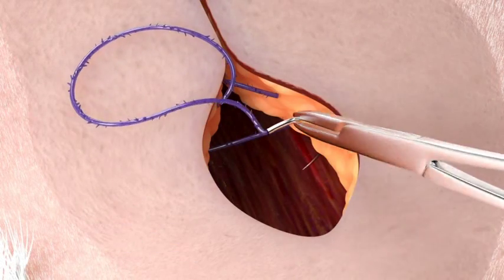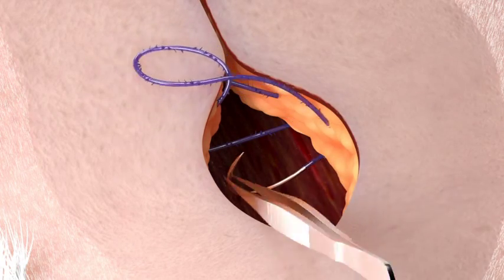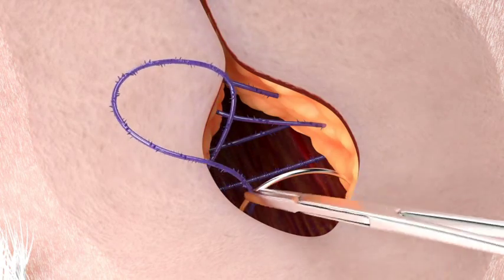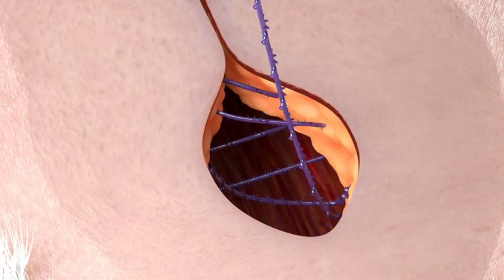You then engage the other arm of the quill device and continue to close the remaining half of this same layer. Do not backstitch and cut this arm of the quill device, as this arm will be used to close the more superficial layer.